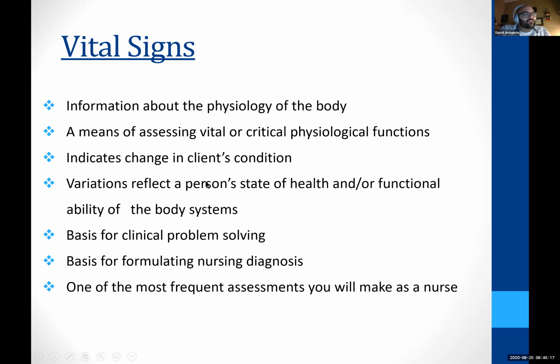So vital signs, a few of you already said this, but it gives you information about the body's overall status. And it can be affected by any body system, renal, cardiac, the integumentary system. Anything can deal with vital signs. For us to measure a vital sign, we have to have something specific. We have to have proper equipment to be able to access and assess vital signs.